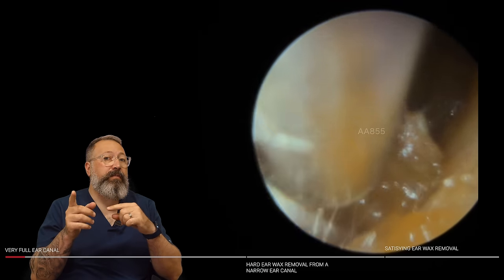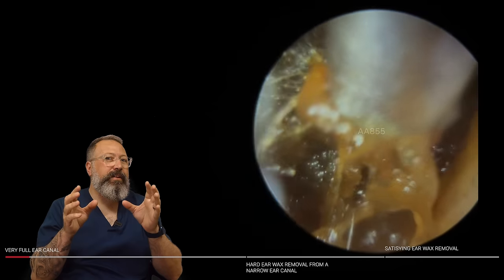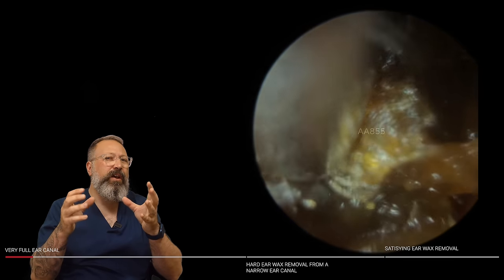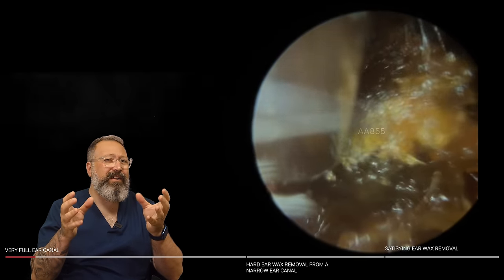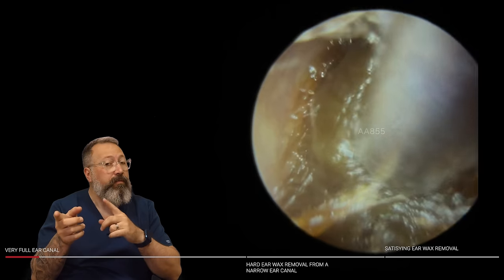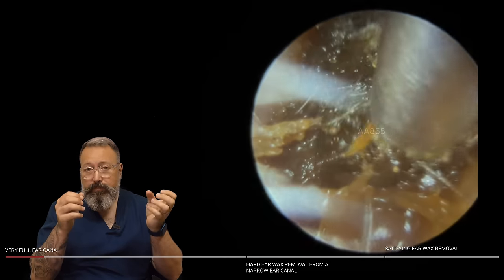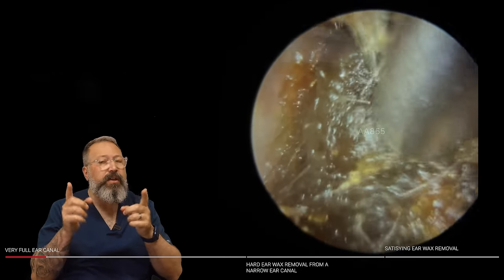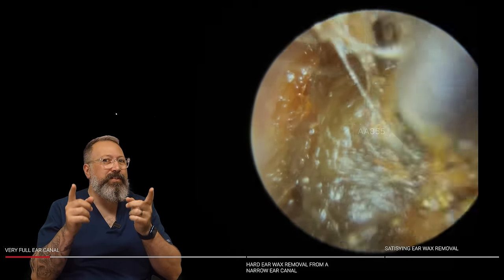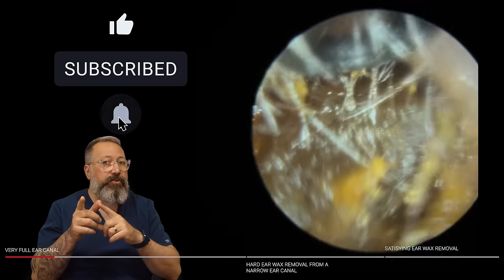Now, you could use a little bit of irrigation on this type of wax and it would work really well. You can see this is almost a bit like the nemesis to the suction tube — it blocks the suction tube very quickly and you get hardly anything out. So this would actually be a great one to use irrigation or a combination of both. This softer wax tends to respond really well to irrigation. This particular patient has had irrigation before and had quite a bad experience at his GP surgery, so really wasn't keen. So I stuck with the suction and some curettage on this one.